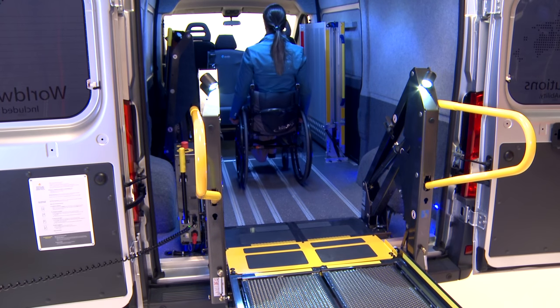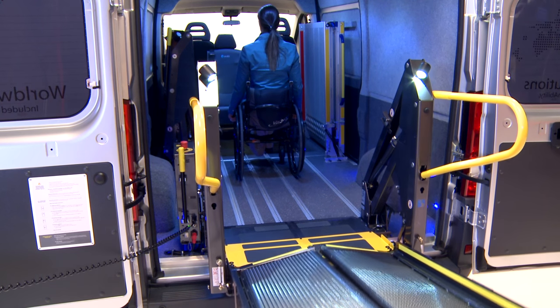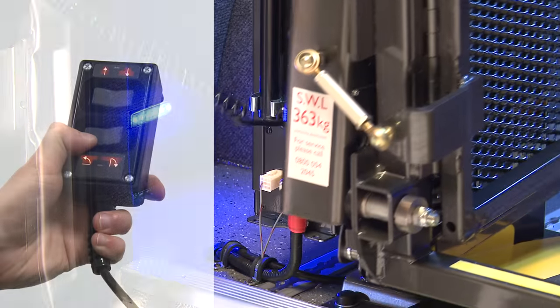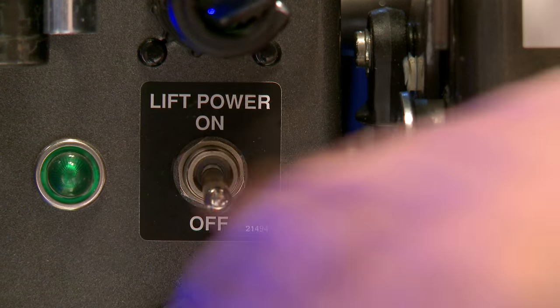Check the footprint of the lift is clear from obstructions and there is sufficient space at the back of the vehicle to allow the lift to fully stow. Press the stow button until the lift is fully stowed into the vehicle. Turn the power off.